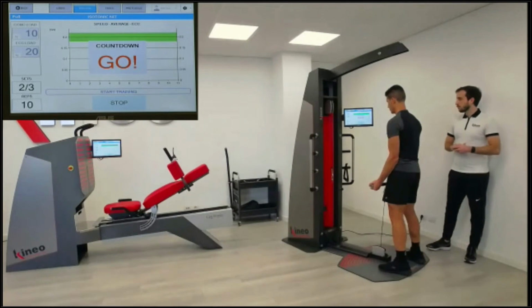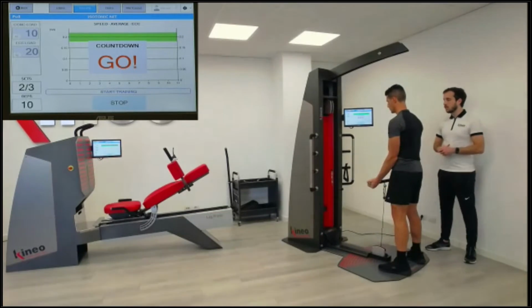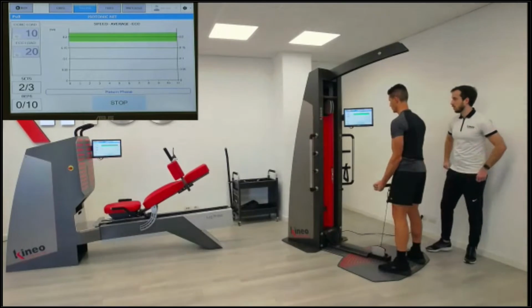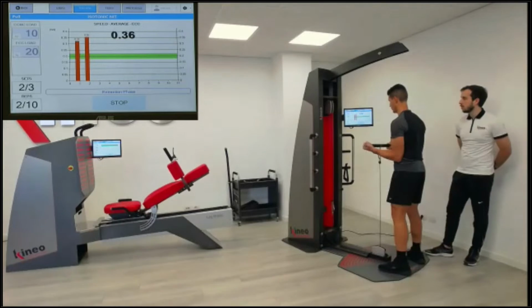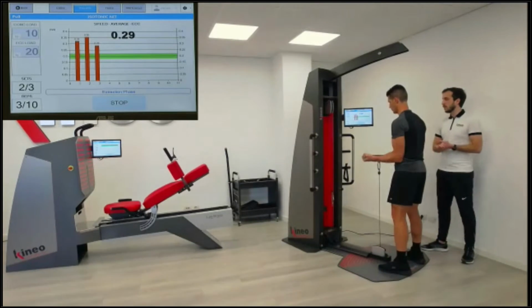Go. The first one is free. All right, now you have it. Perfect. 0.32, too fast, too fast. Slow down in eccentric. All right, better.